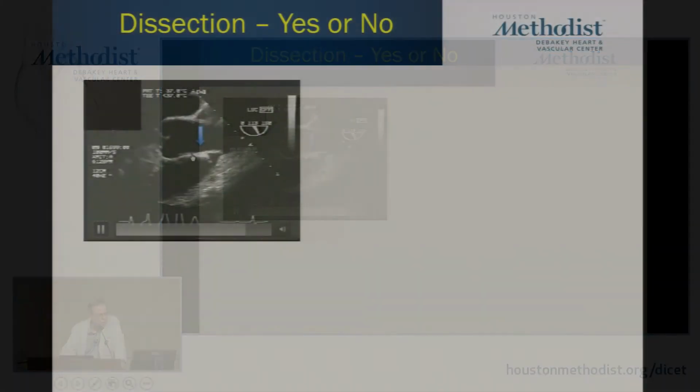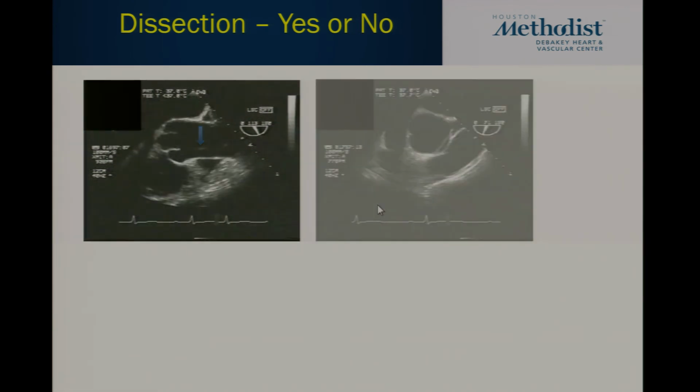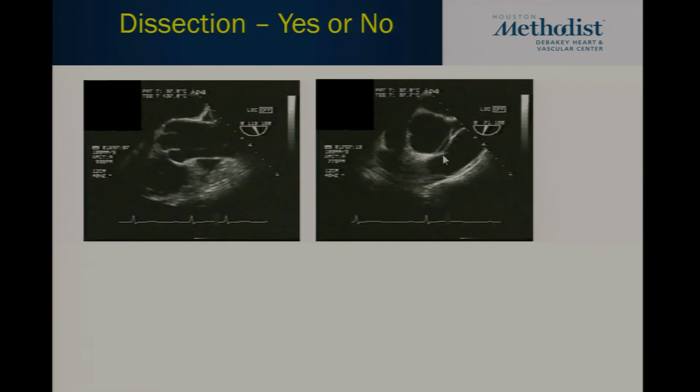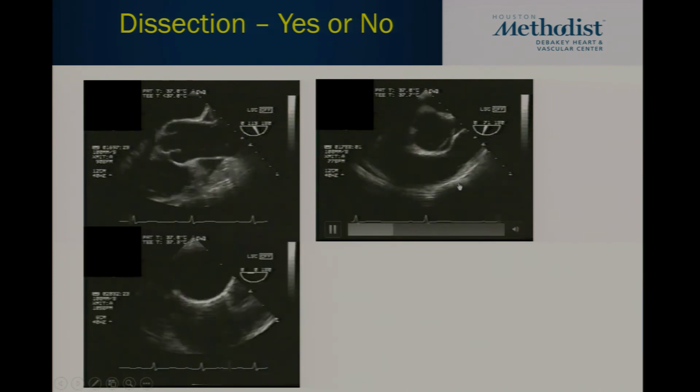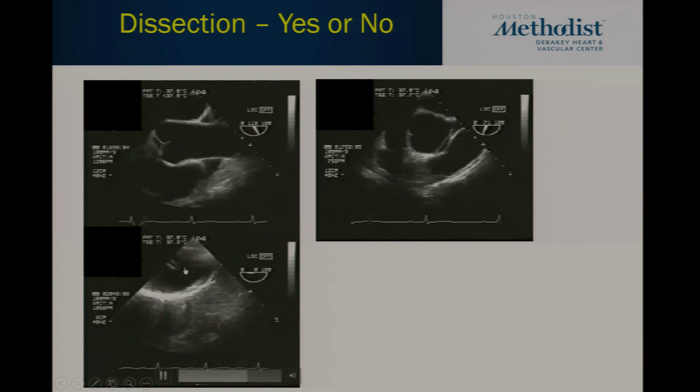This is very subtle in this view, very subtle. But if you can see it, it has a movement of its own. And when you see it on this view, it's more convincing. Look at that. See, that's a movement of its own. And now we even start catching right there. So actually, this was a type 2.